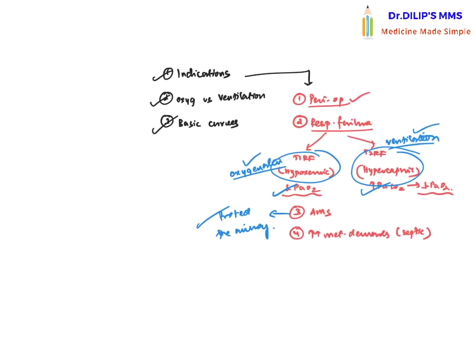So how do you protect an airway? Okay, fine, oxygenation is fine, ventilation is fine, but how do you really protect an airway? Obviously, many endotracheal tubes have something called cuffs, isn't it? The ET tube cuff gets inflated in the trachea. When you inflate this cuff and close the trachea from communicating with the outside atmosphere or pharyngeal or esophageal secretions, that's how you protect the airway and prevent these secretions from getting aspirated. That is how the ET tube protects the airway.